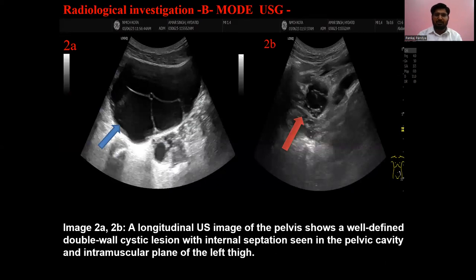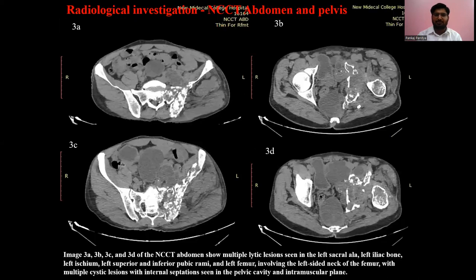On ultrasound, B-mode USG image number 2a and 2b is a longitudinal ultrasound image of the pelvis, showing a well-defined double-walled cystic lesion with internal septation seen in the pelvic cavity, and an intramuscular plane of the left thigh in image number 2b.